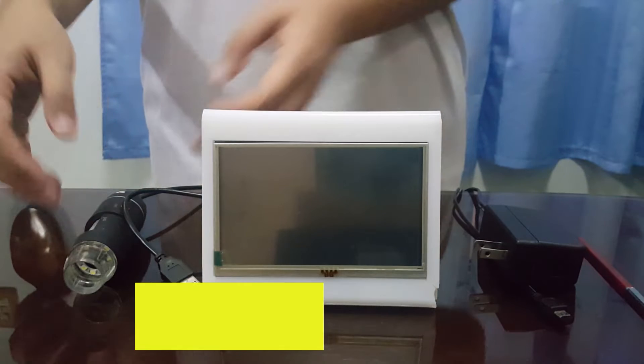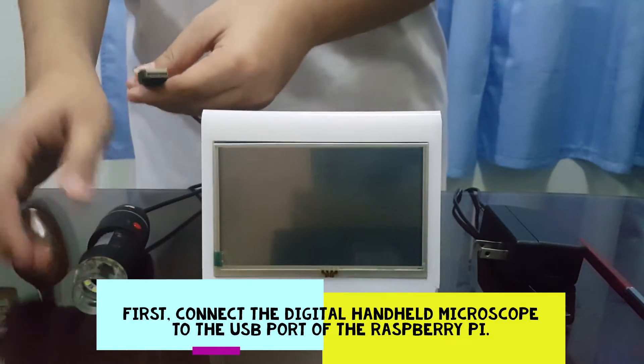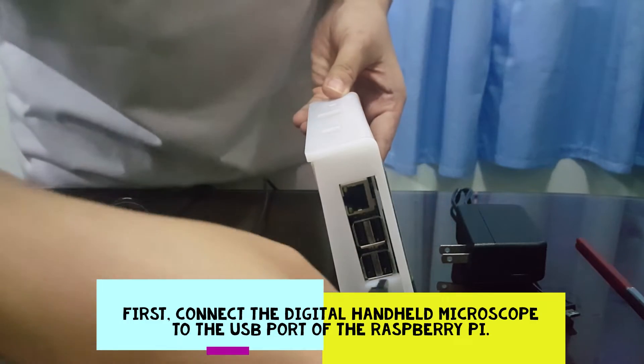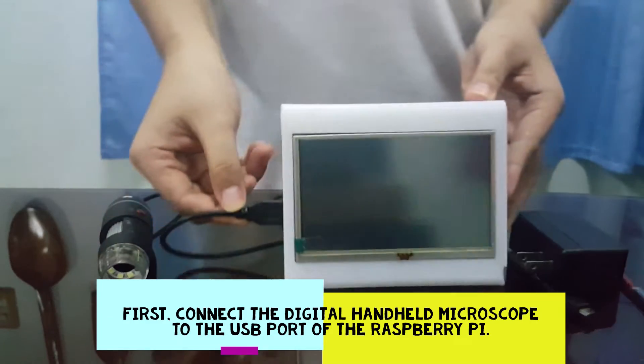How to use the device? First, connect the digital handheld microscope to the USB port of the Raspberry Pi, as this would serve as a prompt for the program to automatically start up.